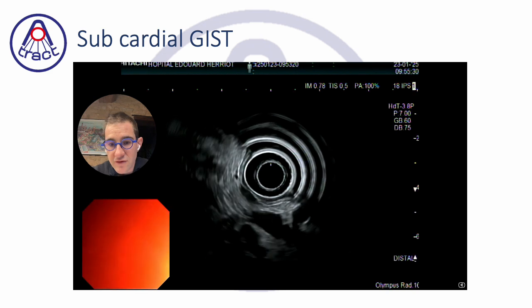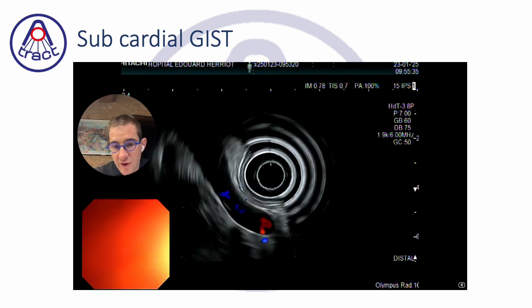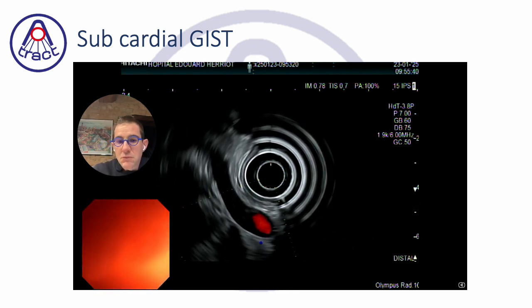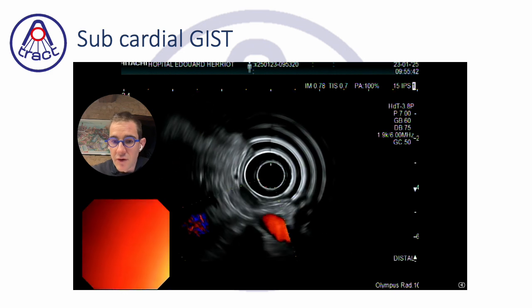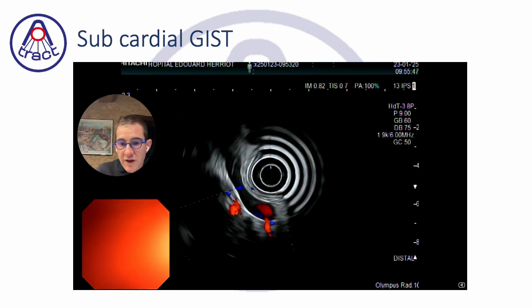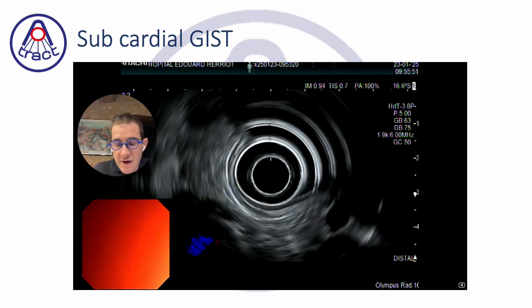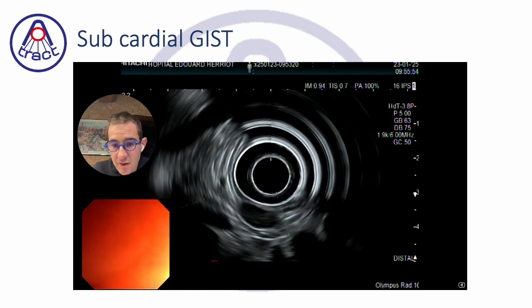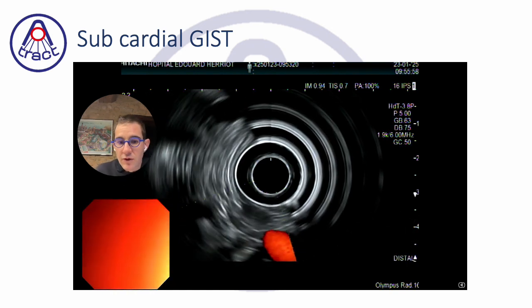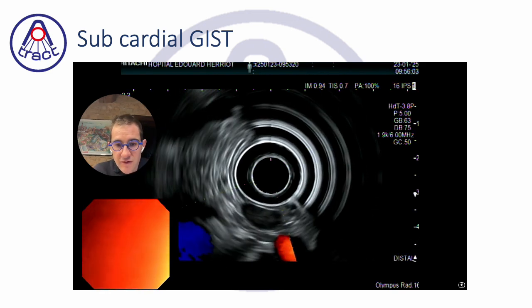We are around 4 centimeters above the cardia on the posterior wall, and the patient is on the back in supine position. So I would say it's the best case for submucosal tunneling endoscopic resection because the scope is on the good axis, the lesion is almost in the axis of the cardia, so probably it seems to be the good case to demonstrate the technique with a relatively short complete case to discuss for this example.